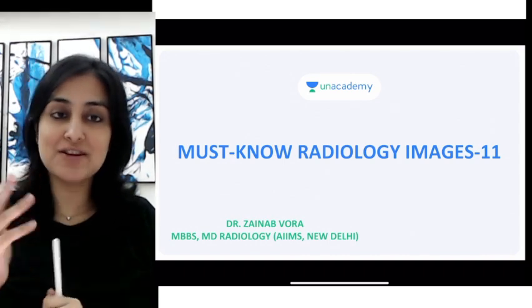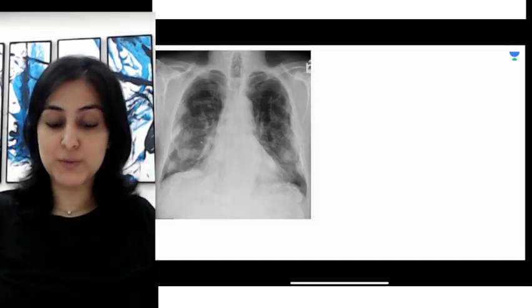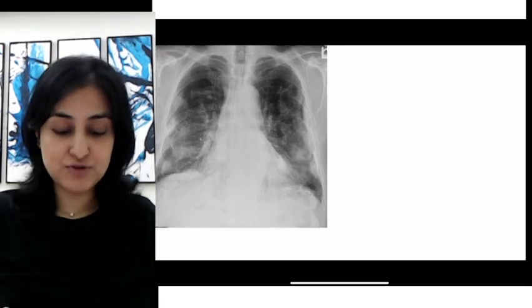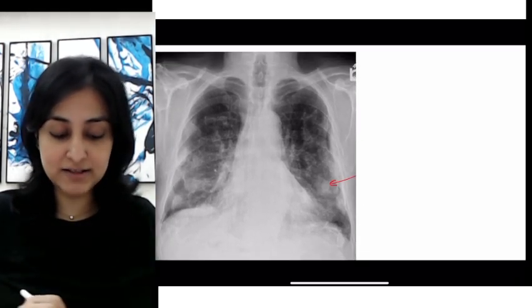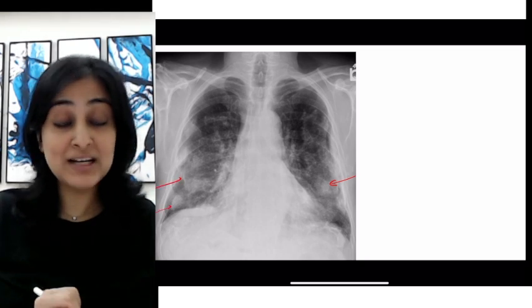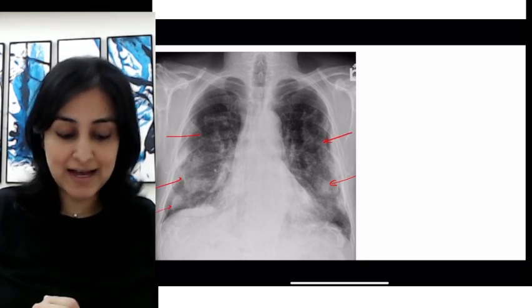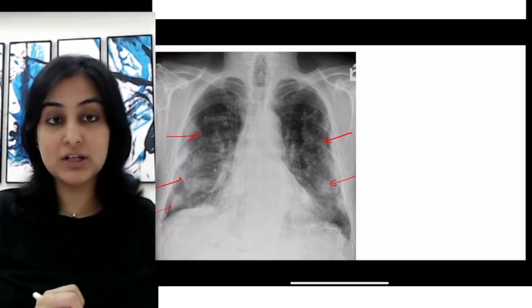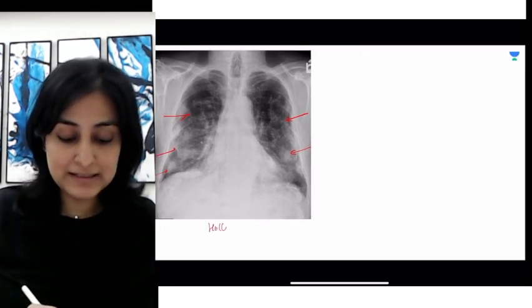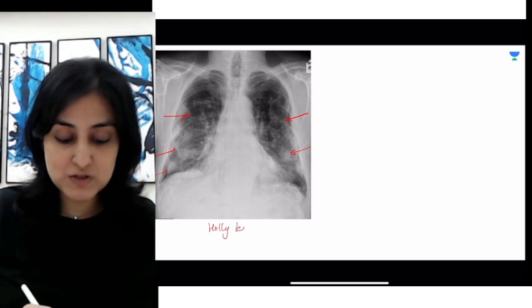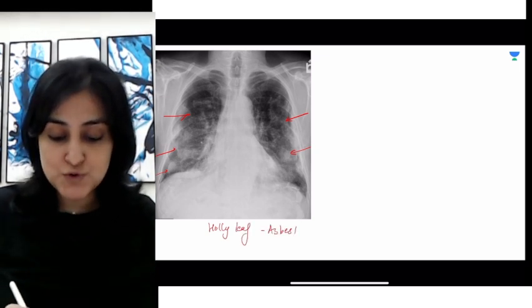There are two leaf signs which are very easily confused on the chest radiograph, and that is what we are going to look at. In this first image, if you look very carefully, you can see various scattered opacities. These are quite dense. These opacities gathered throughout the lung fields have been referred to as the holly leaf sign.